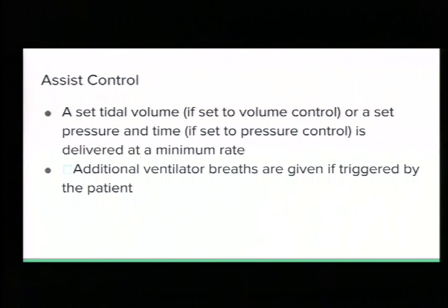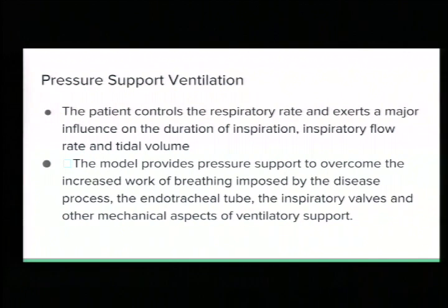So if they're not breathing at all and you set it at 10, they're going to get 10 breaths. If they're breathing at 20, they're going to get 20 assisted breaths. So kind of think of it that way in the simplistic view of it.